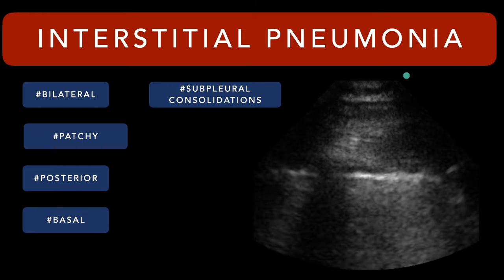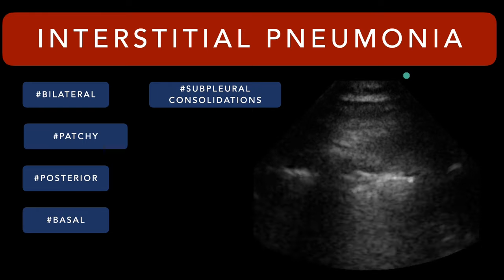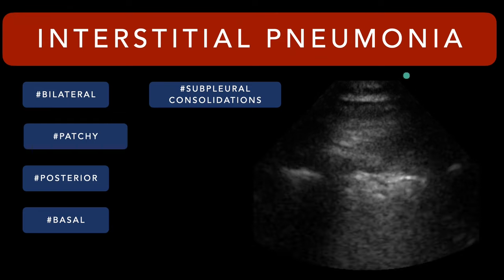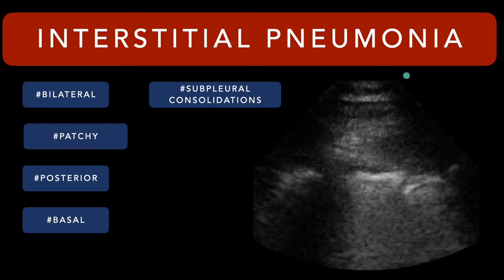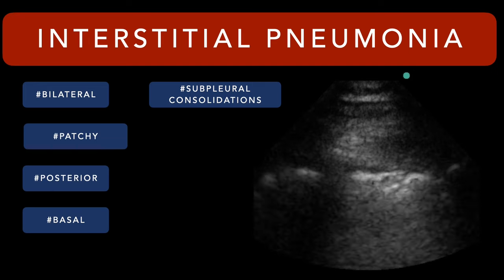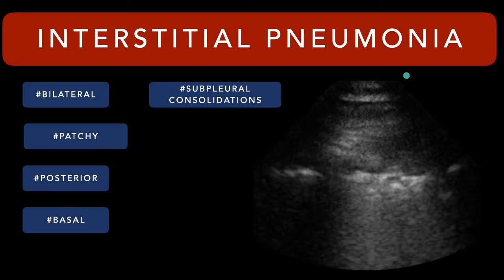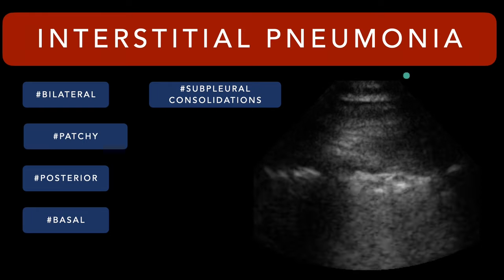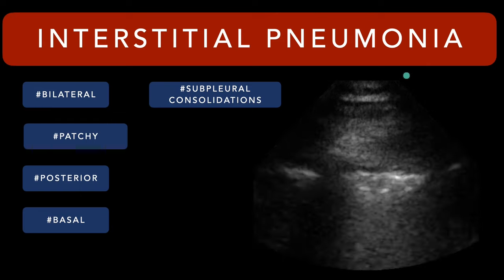However, contrasted to the patient with pulmonary edema, these are probably going to be more likely to be patchy and less likely to be homogeneously distributed throughout the lungs, right? And given the fact that people are either upright or laying flat on their back, and if you've got pneumonia and you feel really crummy, you're probably just laying around in bed, there's going to be some gravity dependency, which is going to pull some of this stuff into the posterior lung fields.